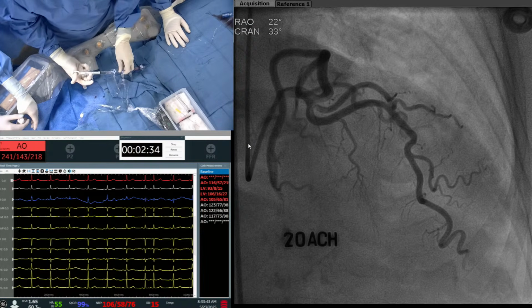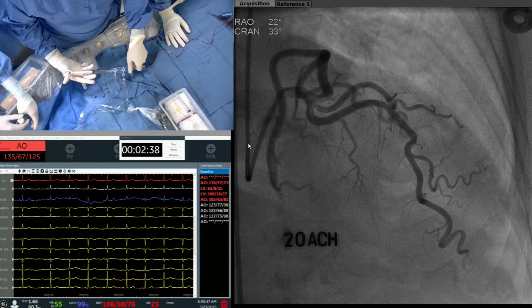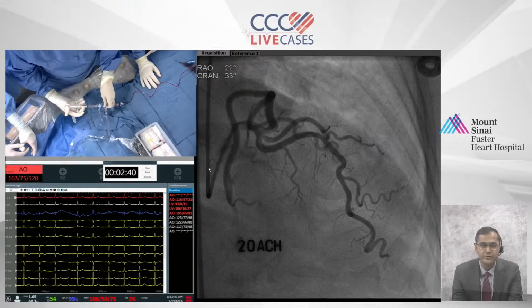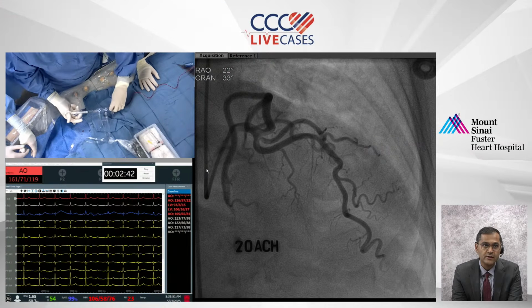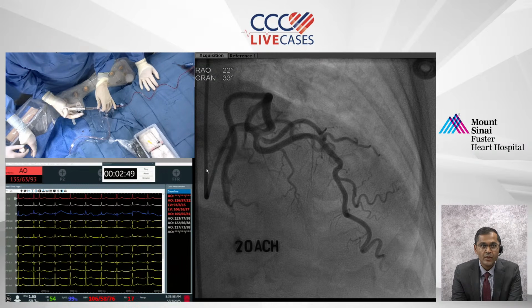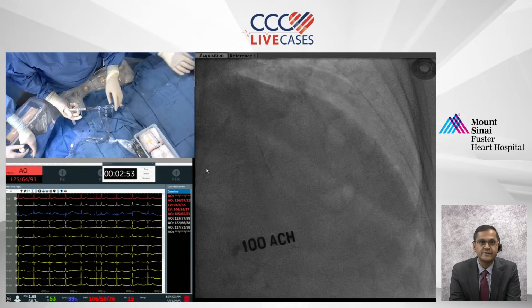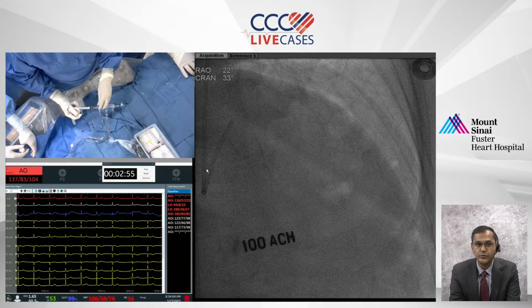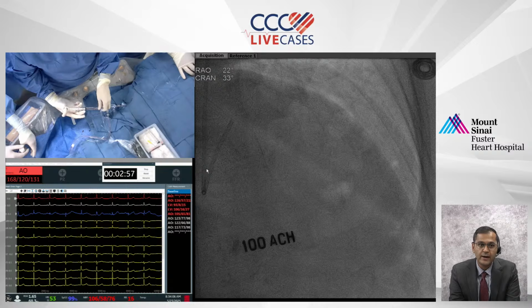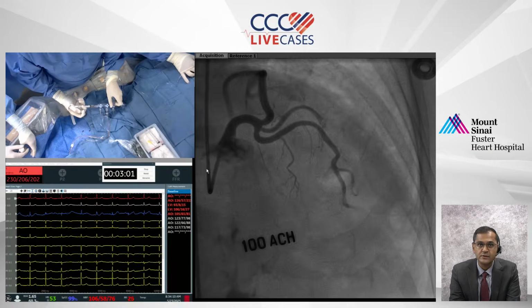Obviously, if she has anything, I slow down. In the Cormica trial, in patients where they didn't have a diagnosis at 100 micrograms, they would bolus 200 micrograms. Great question, something I was going to ask you. Are you doing 200 mics up front? We do, yeah. If we think the patient's clinical syndrome fits and we still don't have an answer, we'll do 200, understanding there's a potential safety risk.